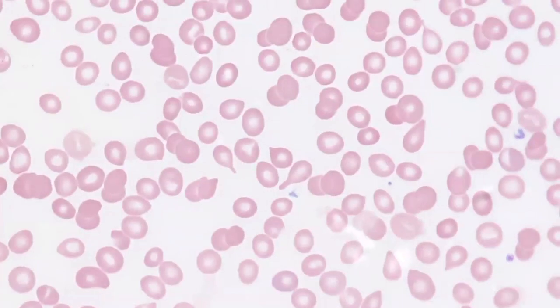I like to think of dacryocytes as being forced out of the bone marrow prematurely. So they get pushed and squeezed out of the bone marrow and they're not ready to leave, and so they try and hang on as long as they can, and that's the little teardrop shape that we see in the peripheral blood. In this case, the teardrop shape is because of myelofibrosis in the bone marrow. The red cells are being squeezed out of a fibrotic marrow.